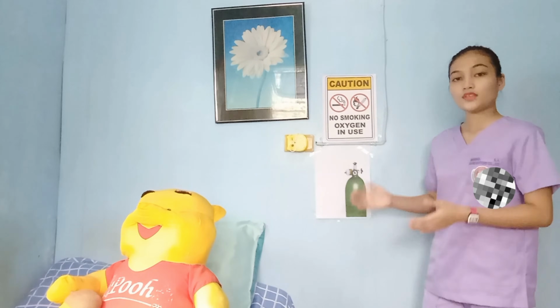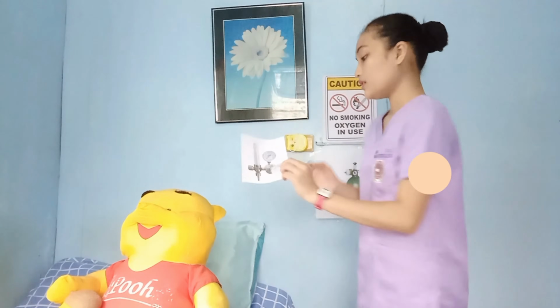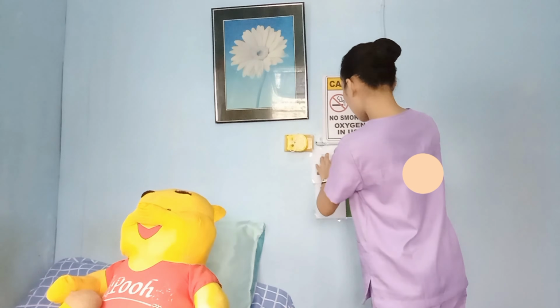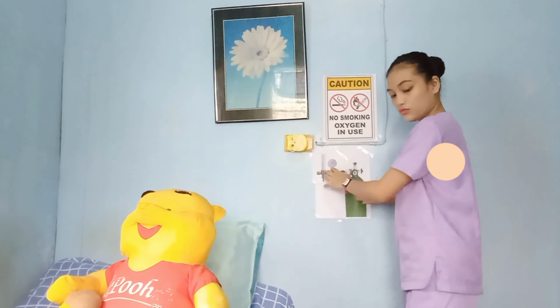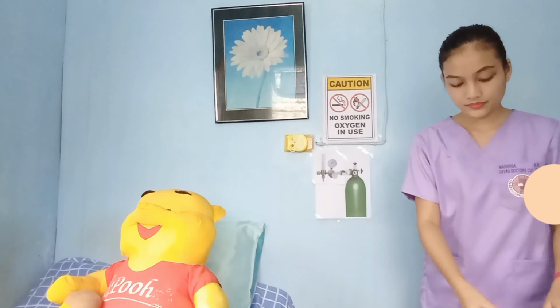Here. So, the first thing to do is to connect the flow meter to the oxygen tank. It should be in the off position. So here is the flow meter. This flow meter is a device that is used to measure or control the flow of oxygen from the oxygen distribution unit, which is our oxygen tank, to our oxygen user.